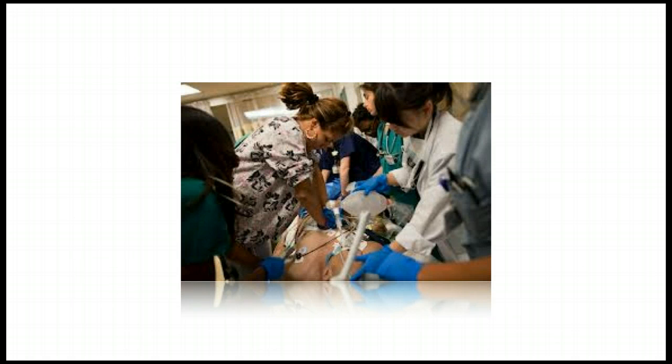So in a patient that is intubated and getting assisted ventilation during cardiac arrest, what's the point? You don't have to worry about hypoventilation or apnea in a patient that EMS or a respiratory therapist is already ventilating appropriately.